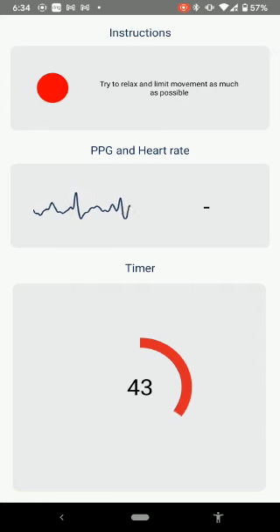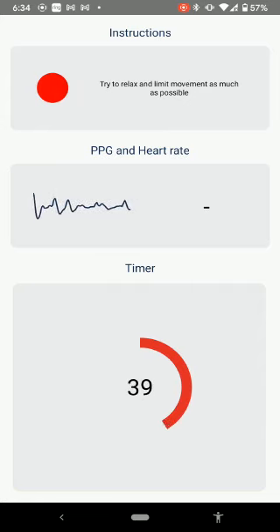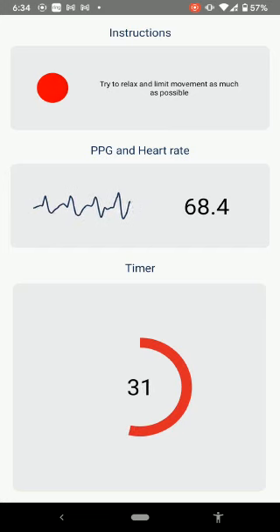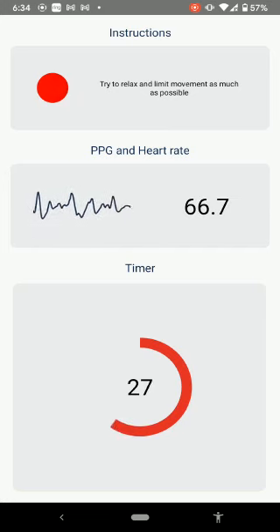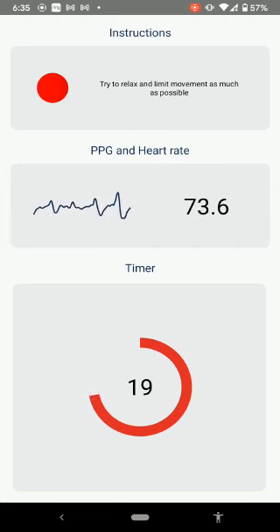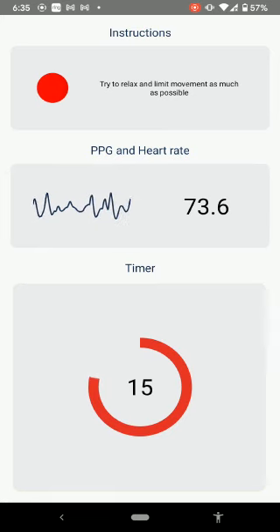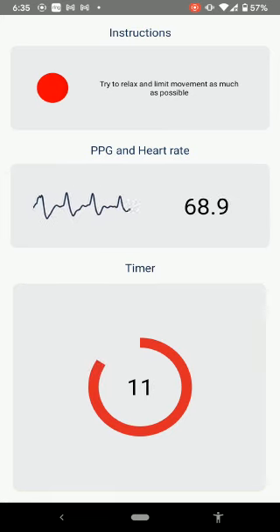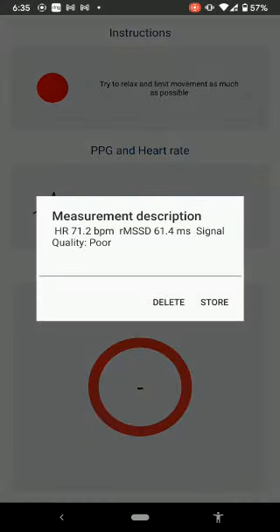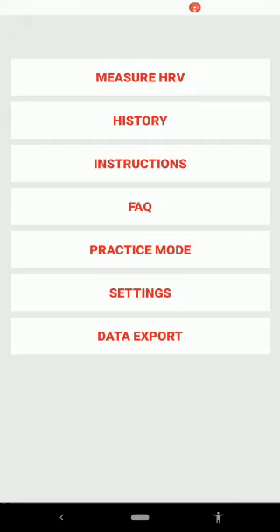You'll notice a red circular breathing bar at the bottom of the screen with a countdown timer. Follow this and slowly breathe in and breathe out for your session — breathe in, hold, breathe out. Once the countdown finishes, a 'measurement description' pop-up appears telling you what your measurement was. Go ahead and click Store to save your data.